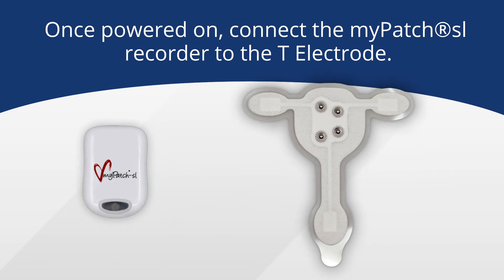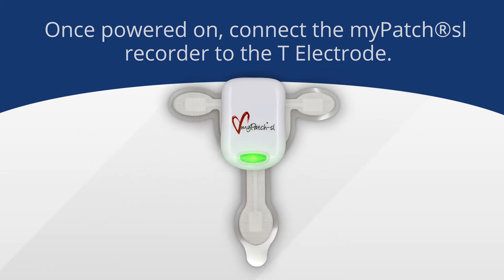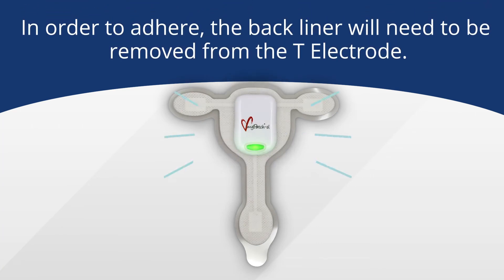Once the recorder is powered on, before adhering anything to the chest, you'll need to attach the recorder to the T electrode. The recorder only attaches one way, so line up the connectors and snap it into place.